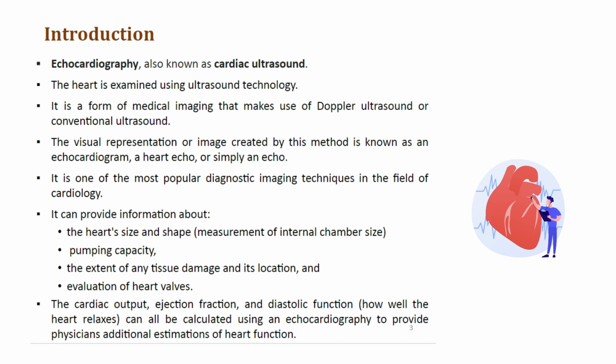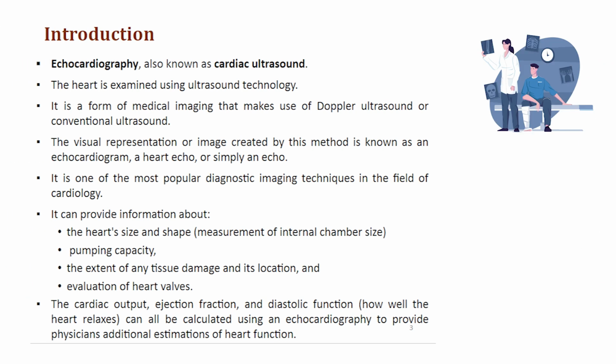It can provide information about the heart's size and shape, means it can measure size of the internal chamber of the heart. It can also provide information about pumping capacity of the heart. It can provide information about the extent of any tissue damage and its location in the heart. It can provide information about evaluation of heart valves.